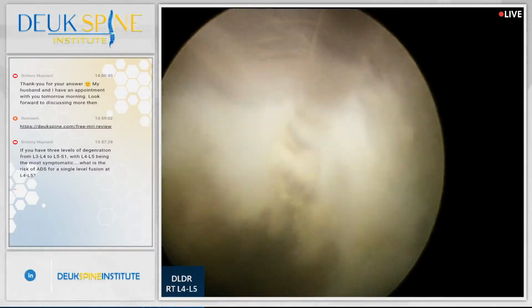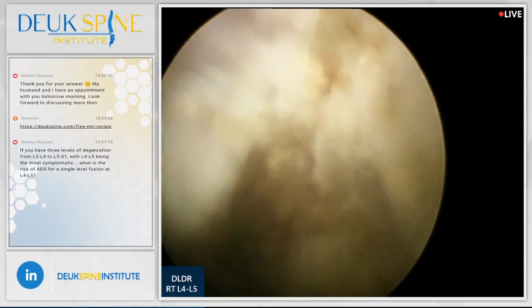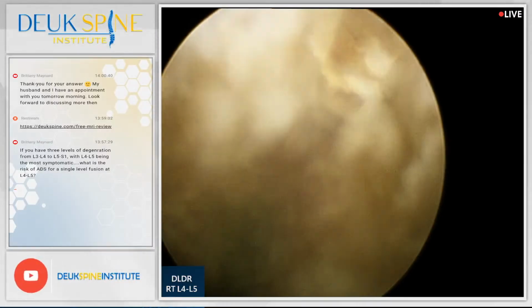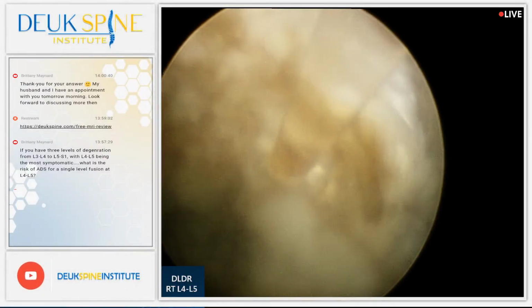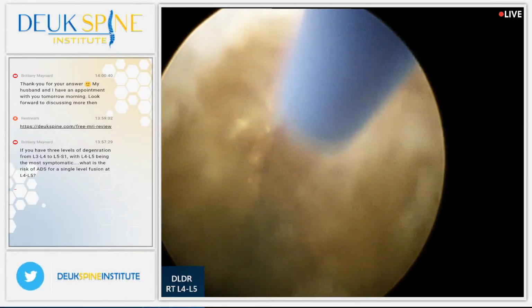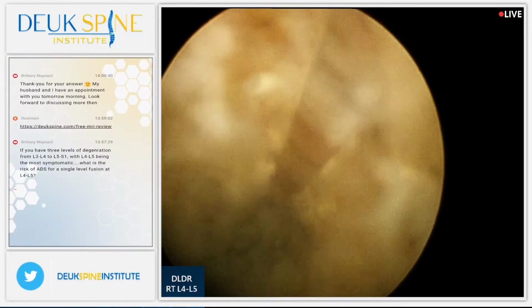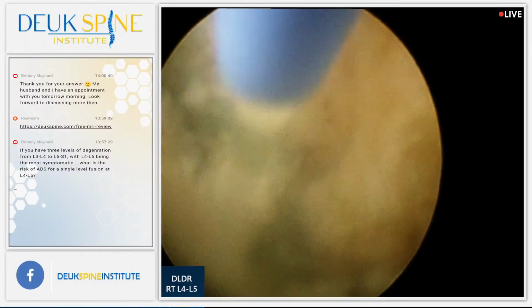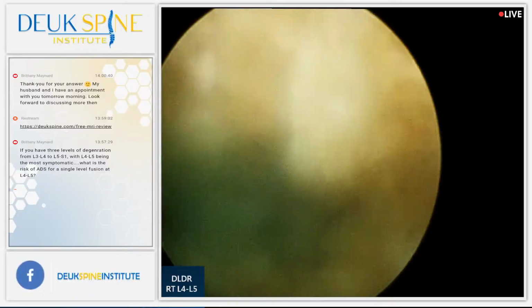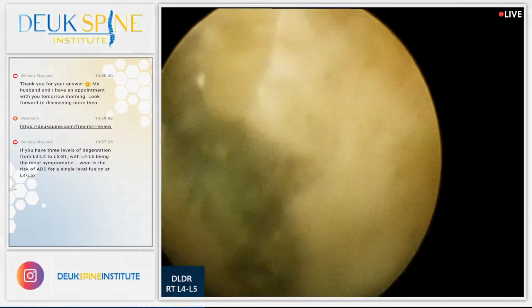Okay, just about done. Another 30 seconds. See how quickly the laser dispatches of all this bad tissue right here? Nikki, you see that? Henry, you see that? Yes, sir. Okay, that's how it's supposed to work. So when you guys see it not working well, obviously we got to change the fiber or change the machine. All right. And 30 seconds left and we're done.